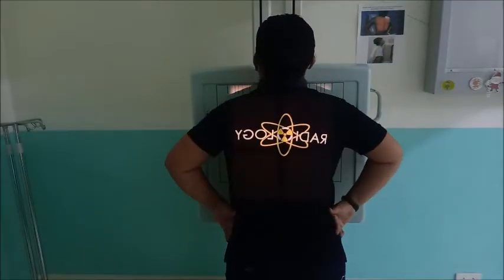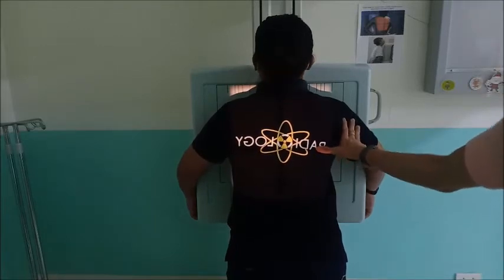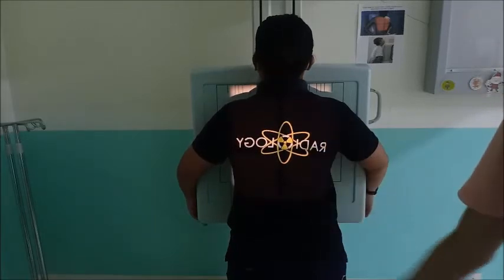Okay, relax now. As you can see, the collimation is set up for a 14 by 14. So it fits, right? At 14 by 14, you can see the patient's shoulder.